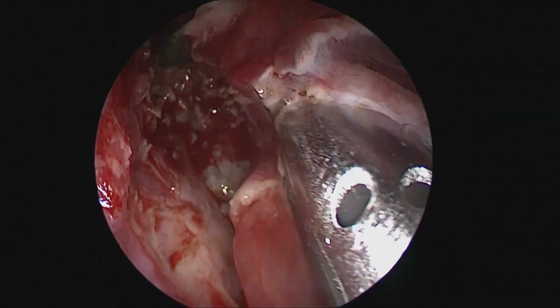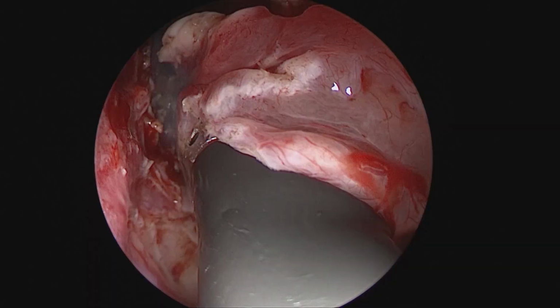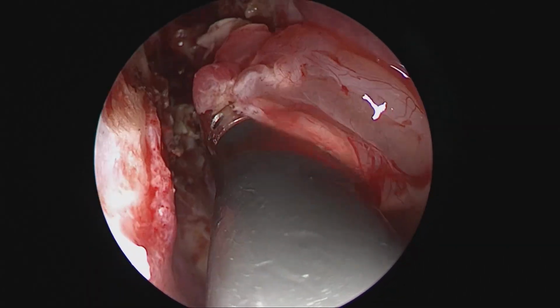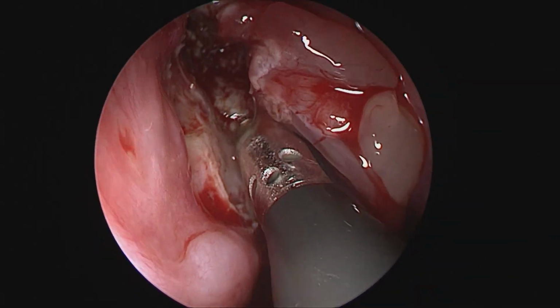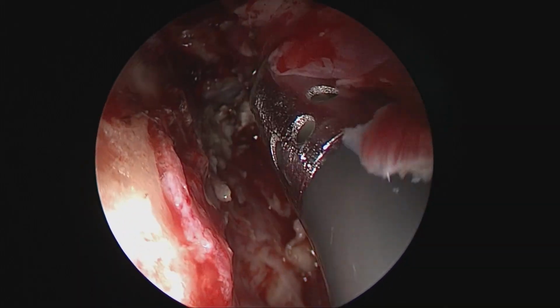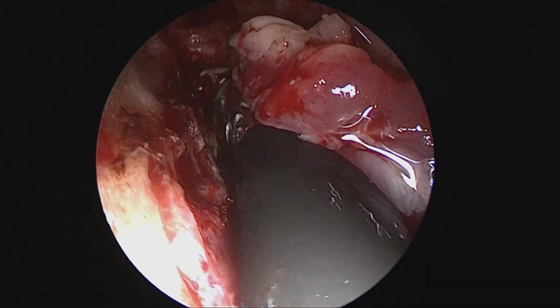And as you also see, the bulk of the tissue does cause some impairment to our vision posteriorly, because it keeps falling onto the coagulation wand because of its suction. So one way is to continue and persist, or sometimes the other way is to remove a big part of it, and then to just focus on whatever posterior portion of this tumor is left, which can be tackled separately.